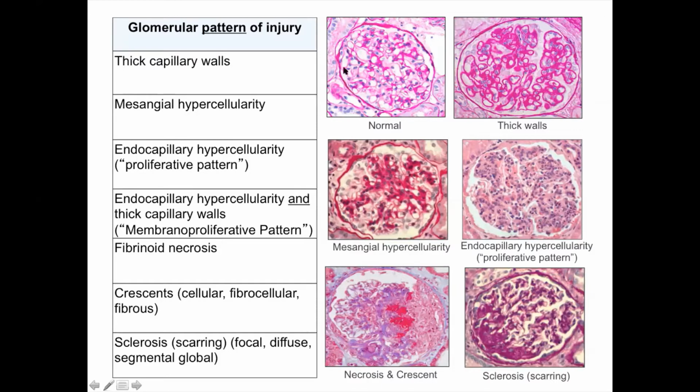Okay, any adhesion هني بيكون معناته إن there is an injury وصار عندنا scarring وصار عندنا sclerosis. Thick walls لما يكون عندنا patency, okay, of the loops, and ما عندنا mesangial hypercellularity، ولكن we have thickened loops، وهذا يبين لنا على ال PAS. Mesangial hypercellularity لما يكون الميزانجيوم expanded and we have increase in the number of cells. إن كل لوب هذه هنا عندنا لوب كم وحدة وياها 1 2 3 4 5 6 okay ف more than 3 to 4 mesangial cells per loop.